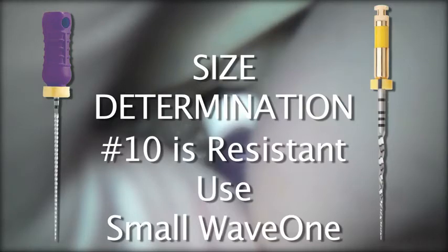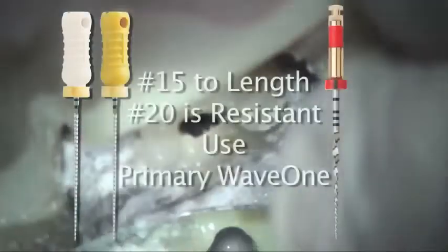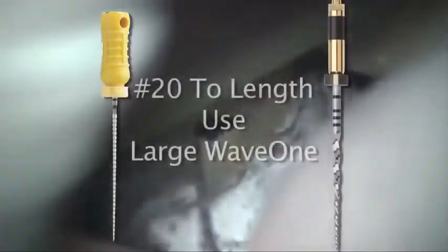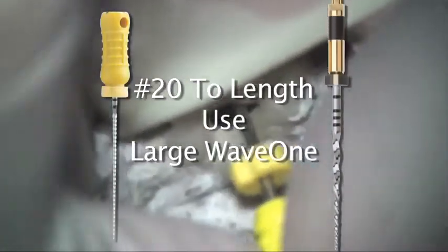In most cases, as we see here, you will follow the number 10 with a number 15K file to see if it reaches easily to the working length. If the number 15K file reaches working length and then a number 20K file doesn't reach the working length, the root canal is considered primary. A loose 20 at length indicates the need for the large Wave 1 instrument, as in the palatal canal of this tooth.